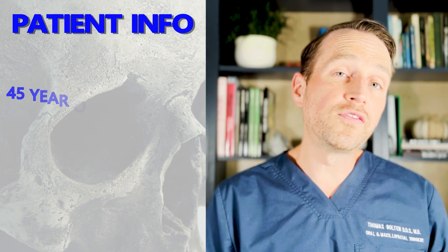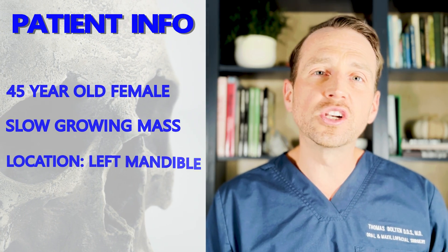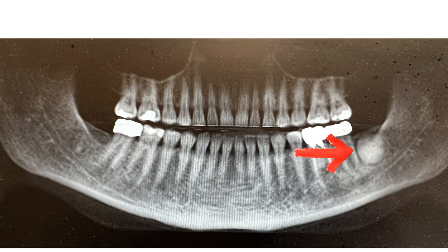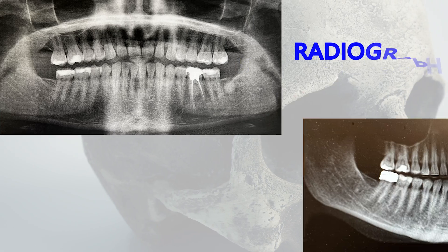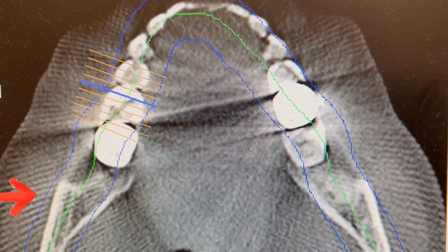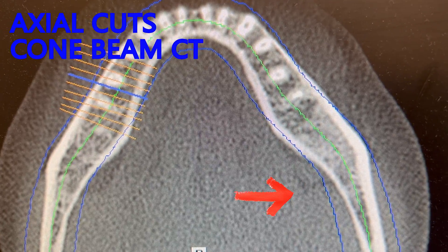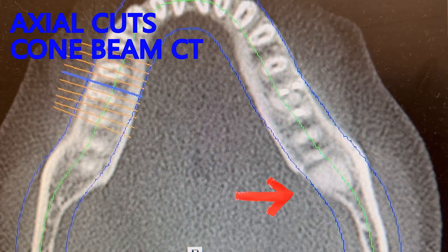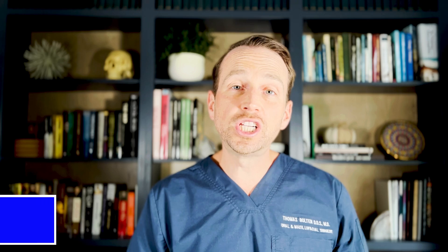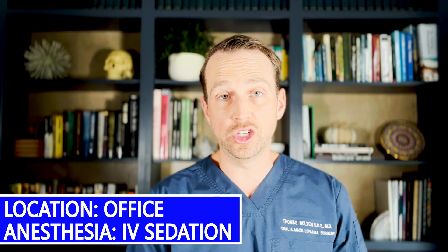Quick refresher: we have a 45-year-old female with a slow-growing mass in her left mandible. She elected to undergo removal of this lesion in the office under IV sedation.